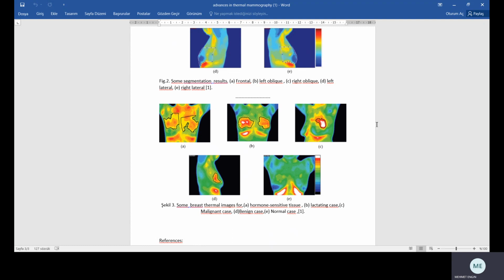Finally, the mean temperature difference between the detected abnormal region and the remaining region of interest is calculated to get the relative increase in temperature compared to the neighboring region. In addition, many other temperature parameters of the abnormal regions can be used for analysis.